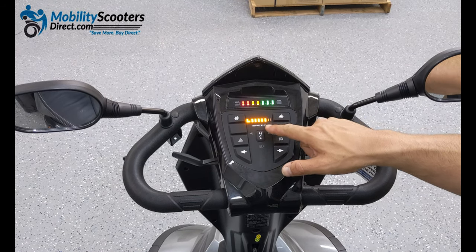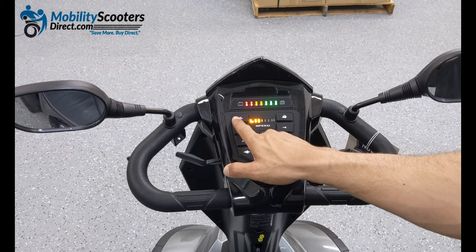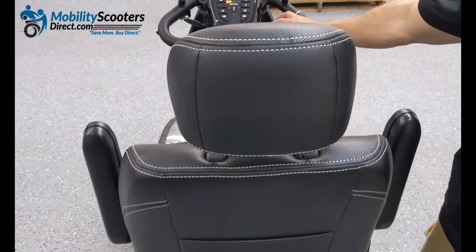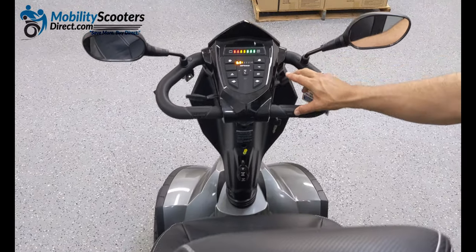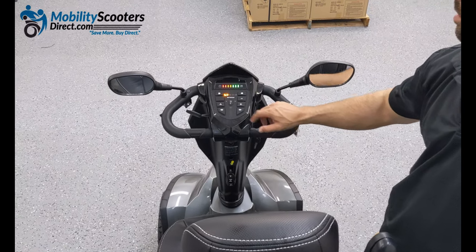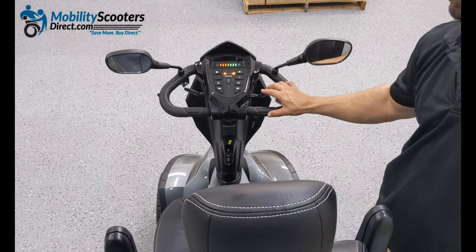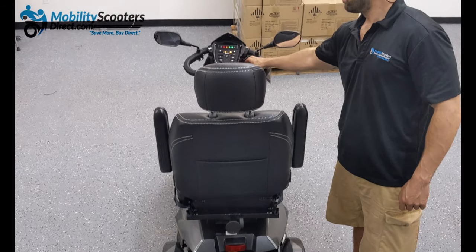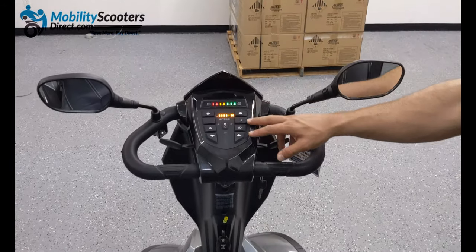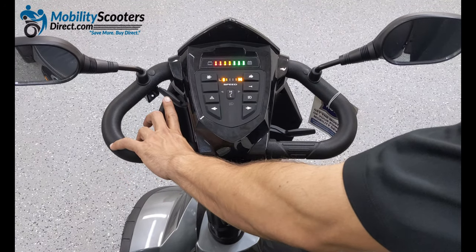There is a second set of lights — that's the speed indicator light. If you hit the turtle button it's going to slow the unit down and some of those yellow lights will disappear. On the right side at the top, the first button you'll see is a rabbit. If you press that button it's going to light up more of the yellow lights on the speed indicator section — the more lights you have lit up the faster it will go. Turtle means slow, rabbit means fast. You can use the scooter with your right or left hand independently. The throttle forward and reverse bars work independently — on the left side you pull back to go backwards and push forward to go forward. With your right hand it's inverted.